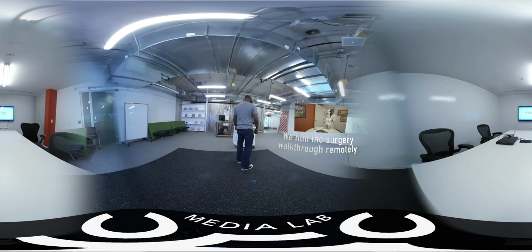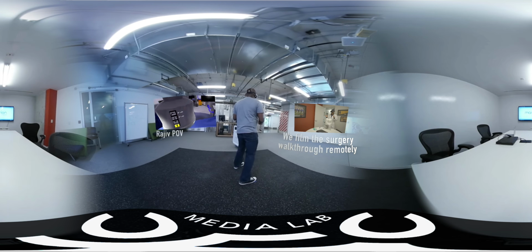Explain to me the PCNL procedure. Actually, show me. Okay, so we're going to do what's called a percutaneous nephrolithotomy. As you can see, we're in an operating room right here. There's a patient in front of me. The patient is on their abdomen, so they're prone. The kidneys tend to be towards the back.